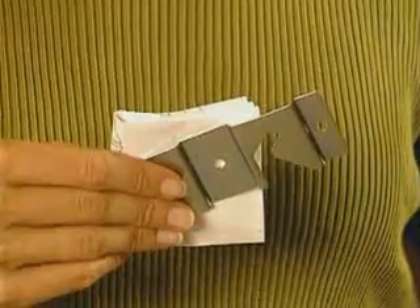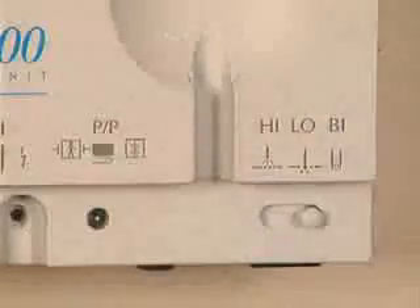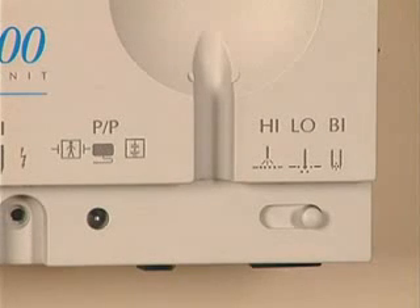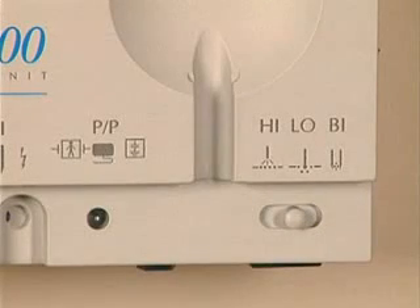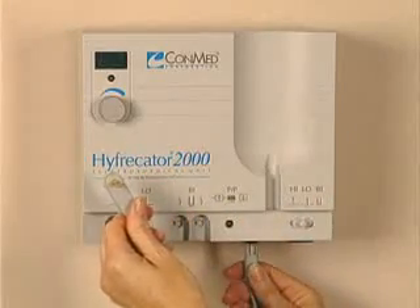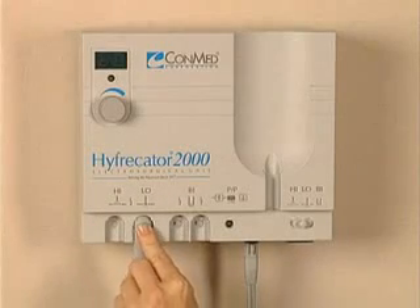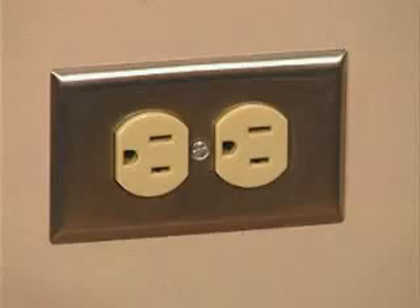Setting up and using your Conmed Hyfercator 2000 is easy. First, decide where to mount the unit — on the wall or on a portable stand. The wall mounting kit with assembly instructions is contained in your box. You can purchase the Conmed mobile stand separately from your local medical distributor. Next, slide the power mode selector switch on the right side of the unit to designate the mode: low, high, or bipolar. There are two plugs on the pencil — the larger one is inserted into the bottom of the unit, and the smaller one is connected to the power terminal corresponding to the mode designated by the selector switch. In most cases, low. Now plug the power cord into the wall.